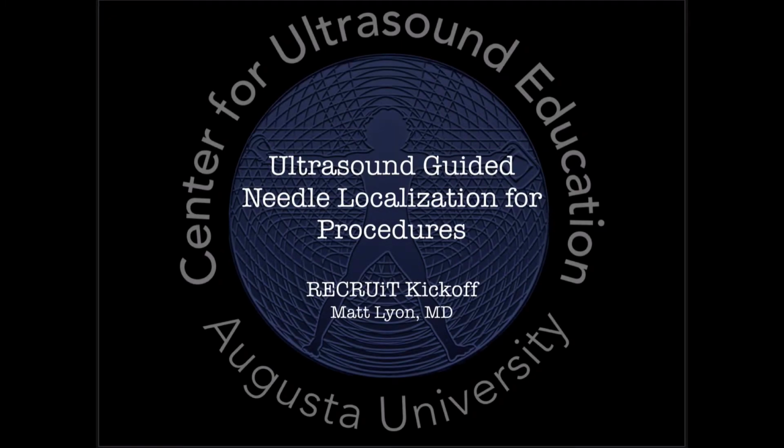Ultrasound guidance for needle localization for procedures. So what I'm going to teach you is how to visualize a needle with ultrasound. Now, I gave or loaned an ultrasound phantom to your residency to practice this on. None of these concepts are going to make a lot of sense until you practice.